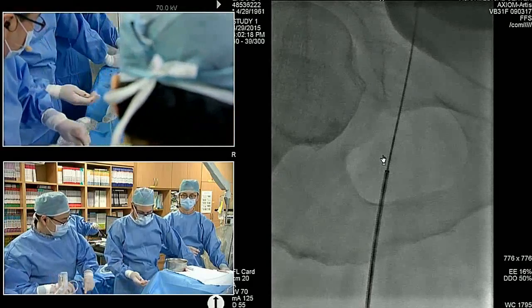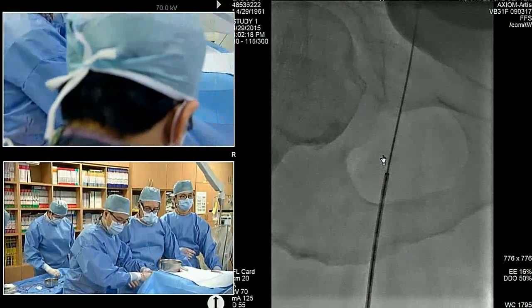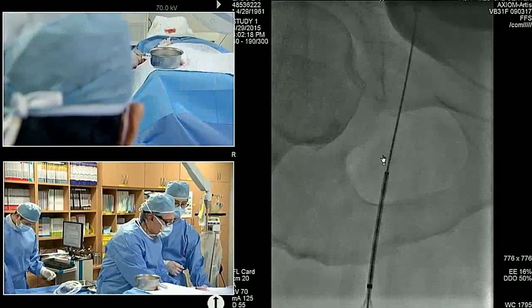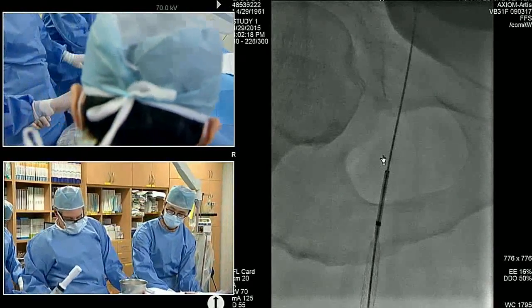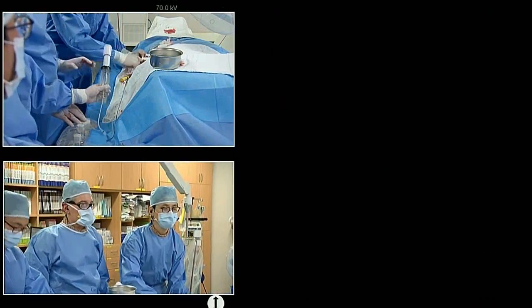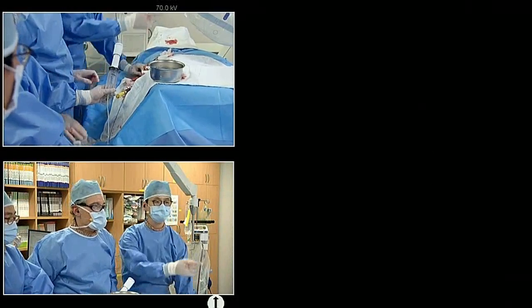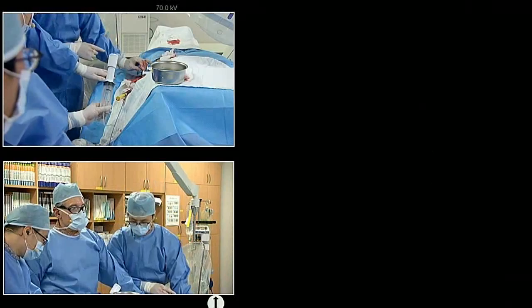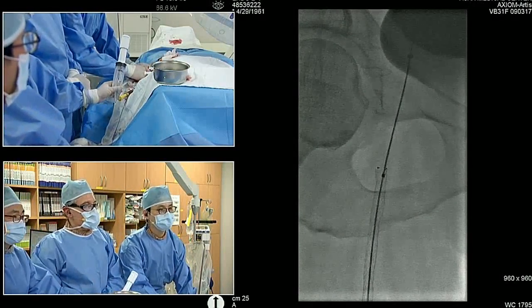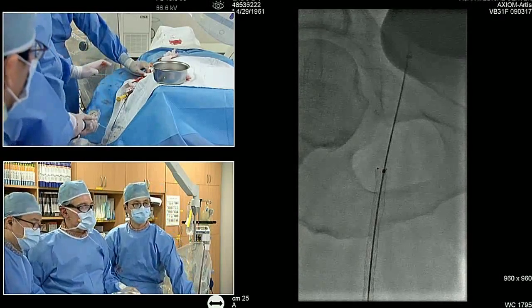Bob, you made the stent delivery or release look easy. I think that the release mechanism on Zilver PTX is incredibly hard. Are there any tips or tricks to deploying it so that you can hit that origin pretty well? Yeah, it is hard. The first trick is to just release the initial friction and get the stent to the end of the delivery system. And then you take your time after that. This one was not as hard. For some reason, it was reasonable.